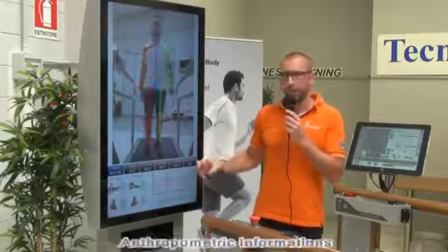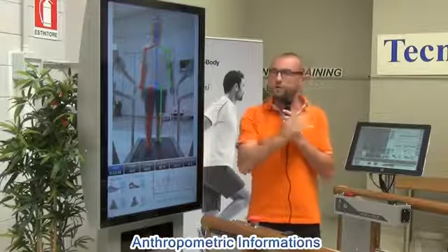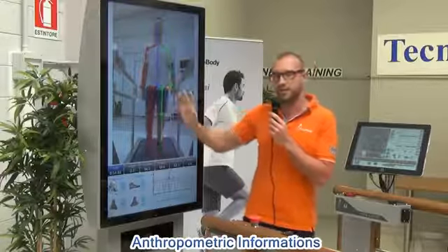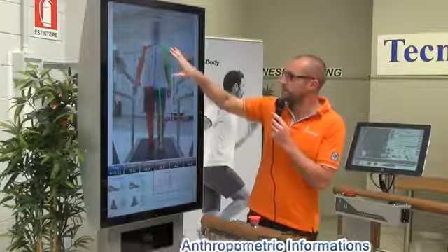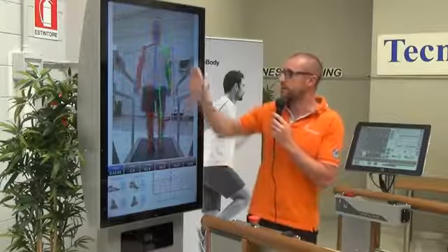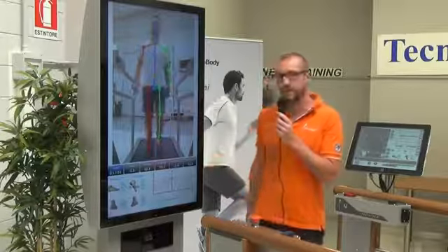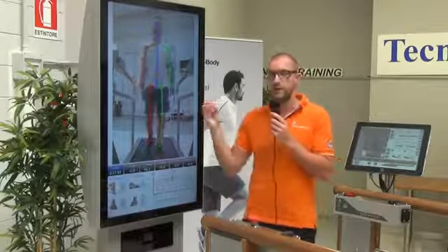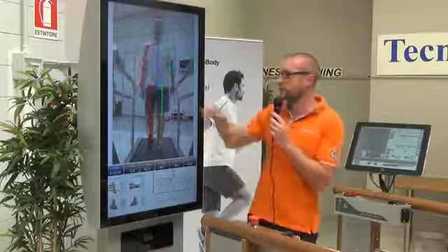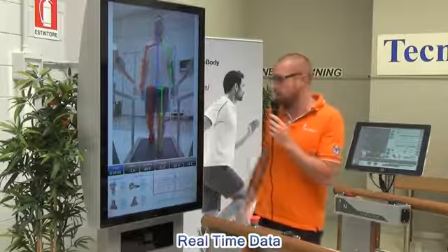Always through the camera, you can see that automatically the body of our user is divided, the right side compared to the left side. And this you can see very easily: the green side is the right side of our user, compared to the left, that is the red part. So very important to give the first feedback, biofeedback, to our customer, and to start to give some analysis of, in this case, this walk.